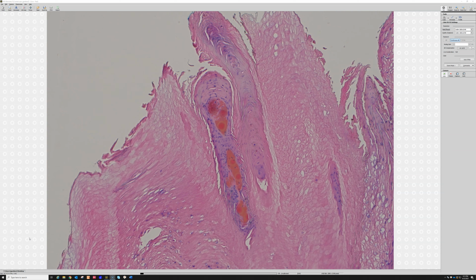Remember that even though blood looks red under the microscope, it's because we put hematoxylin and eosin stain on here, and it's picked up some of the eosin, and it makes it look more red. I mean, it does look red, obviously, when we bleed, but also I think our staining changes how bright that color is. And when there's blood or hemorrhage in the skin or in something, it often looks dark or even black to the naked eye. So these little black dots are actually not black under the microscope. They're just little hemorrhages that are caught in the top.